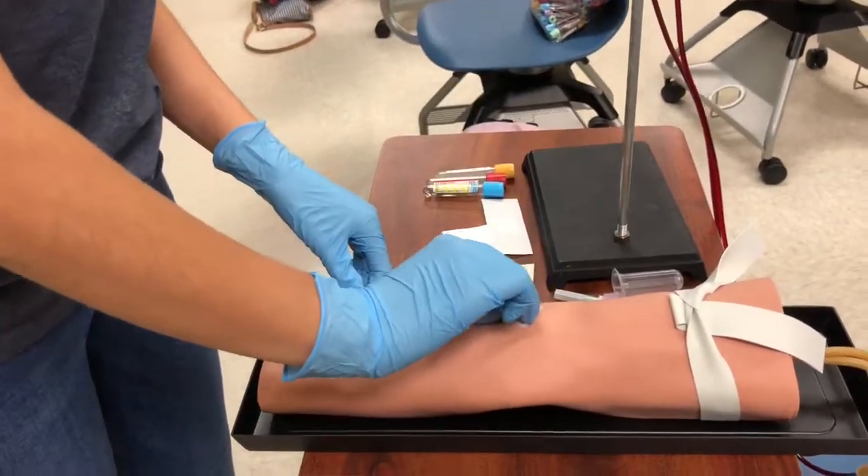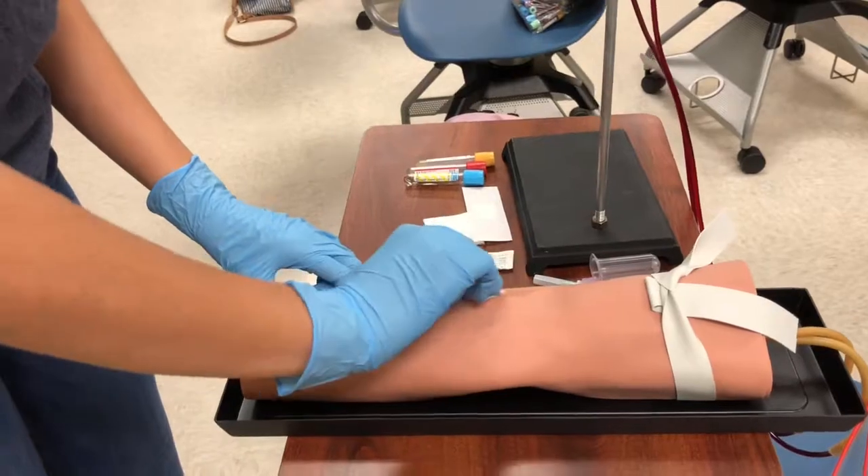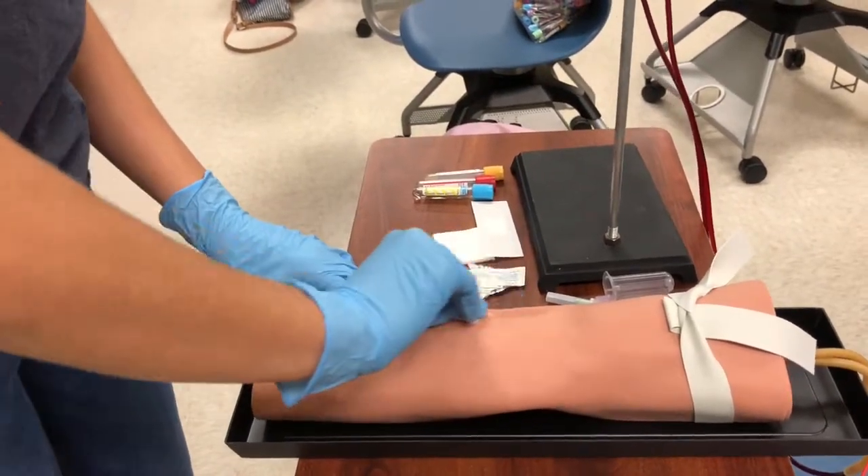Now I open the alcohol wipe and clean the patient's arm. This is where I will be performing the venipuncture technique, so I make sure to get the entire area.